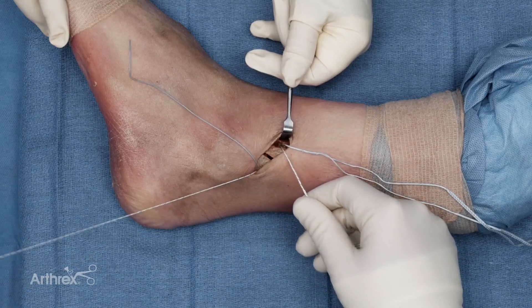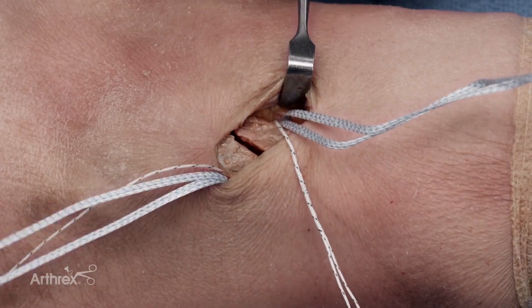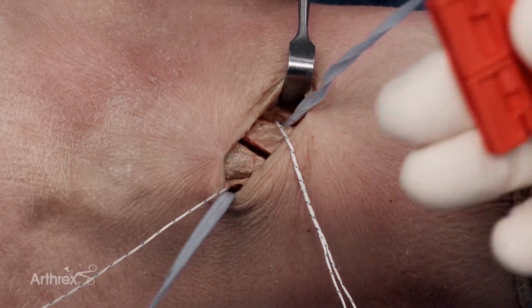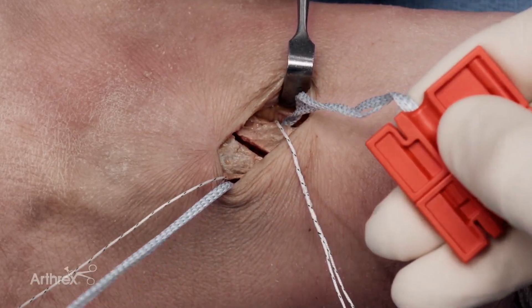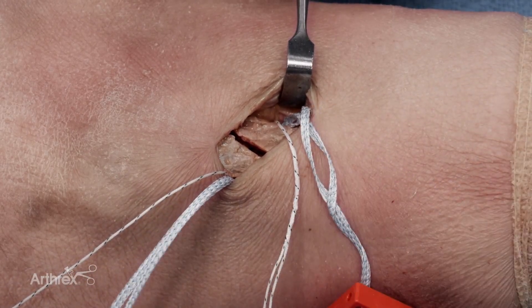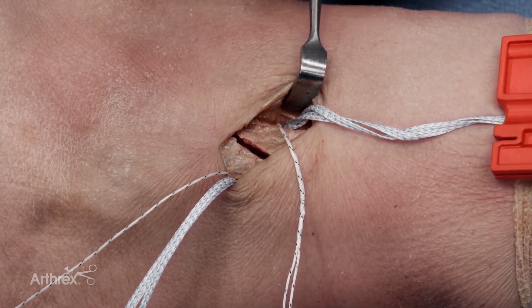Now that the fiber tape cerclage and the fiber link have been passed around the fibula, one key thing for the second pass is to bring the entire fiber tape cerclage very close to the bone. This keeps you from having to overcome as much friction when you eventually tension the fiber tape cerclage.